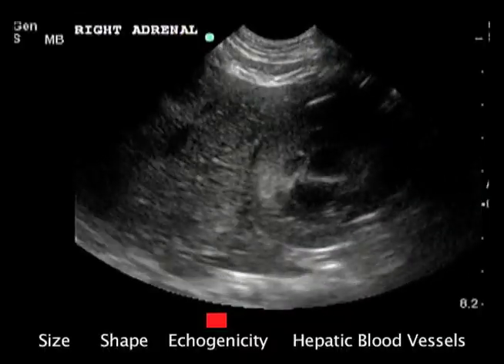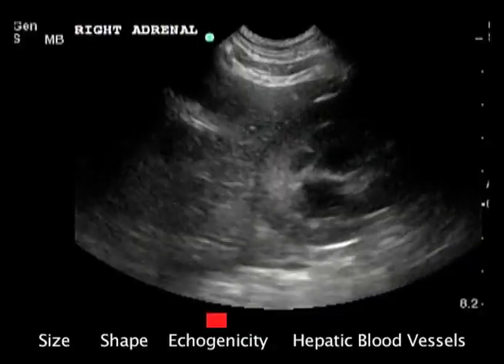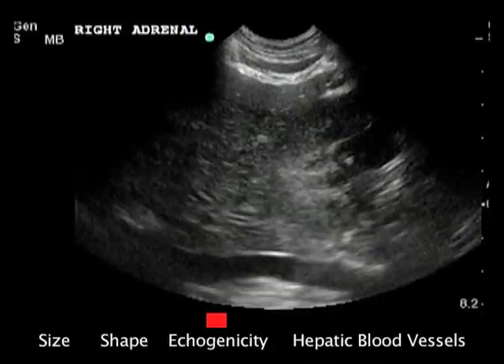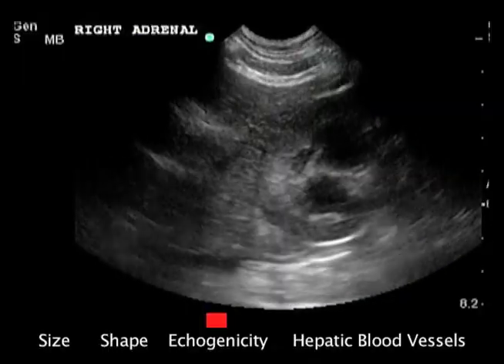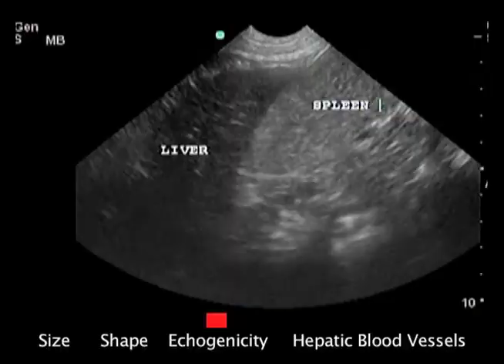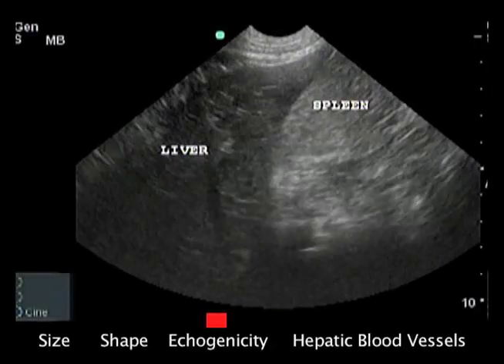Note the mild difference between the caudate liver lobe and cranial pole of the right kidney in this right lateral sagittal view of a dog with a ruptured splenic tumor. Normal liver is usually less echogenic than normal parenchyma of the spleen.